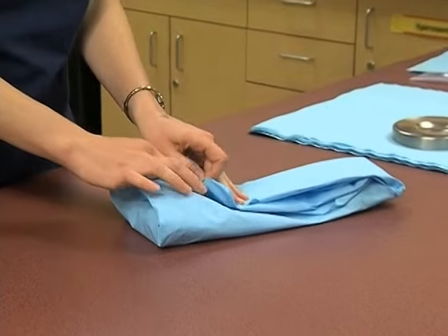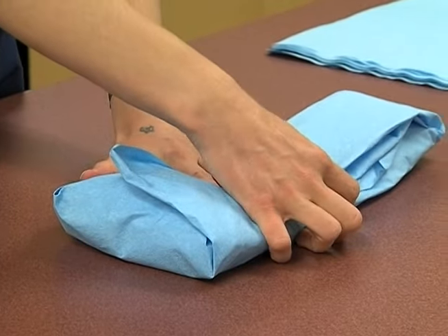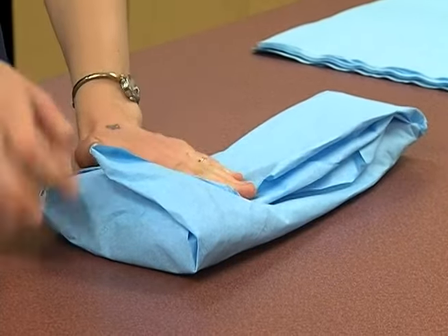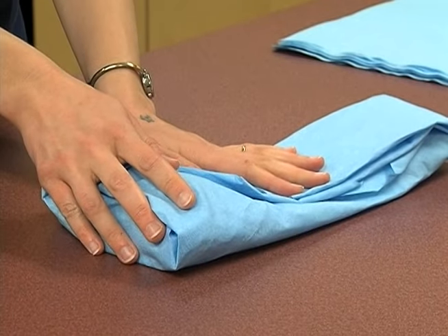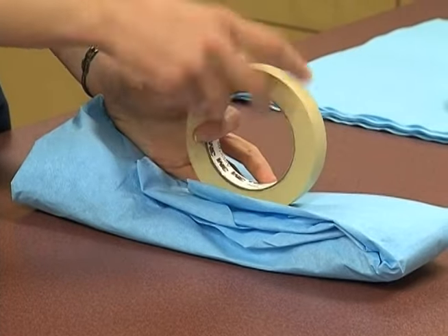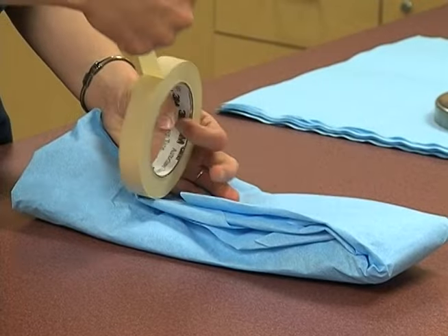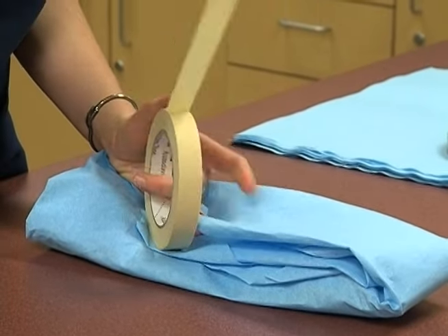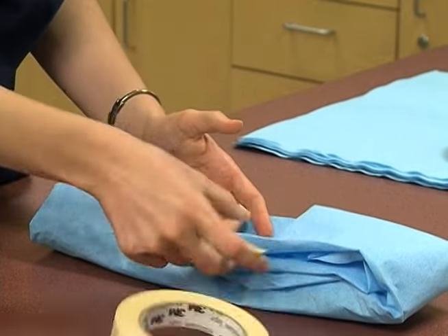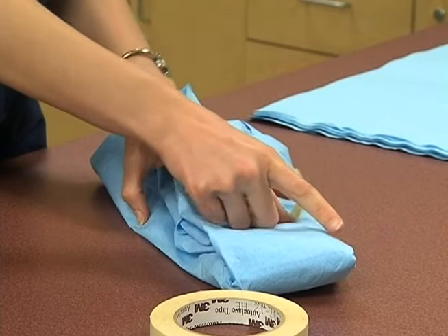Our end product does not need very much tape to keep it closed. It is tight, but not too tight. It allows for airflow inside the package, but keeps everything well bundled. The tape we're going to use to close up our pack is very specific tape. This is autoclave tape. It can handle the temperatures that we're going to put it through in the autoclave, and it also has an indicator built in onto the tape.